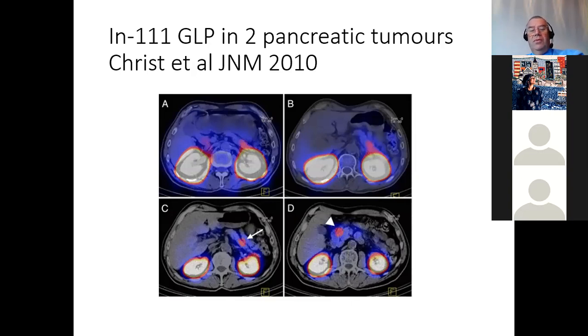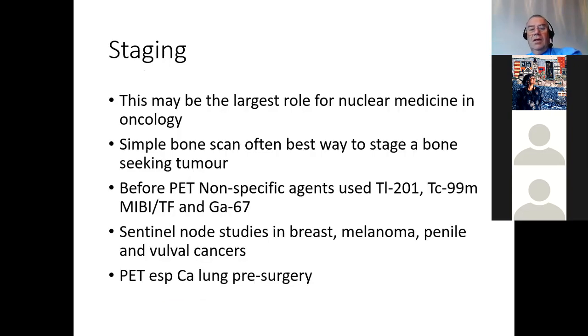These are 4 different patients showing normal studies, and 2 abnormal studies showing focal uptake. And both these insulinomas were less than about 6 millimeters, which are sometimes difficult to see with somatostatin analogs, which tend to be negative in about 50% of insulinomas.